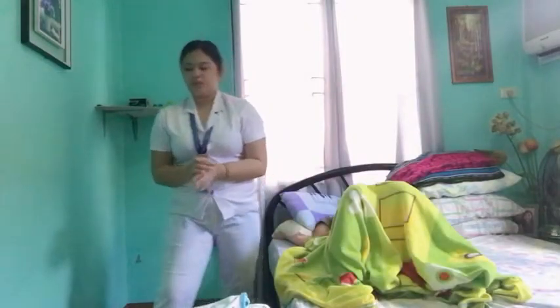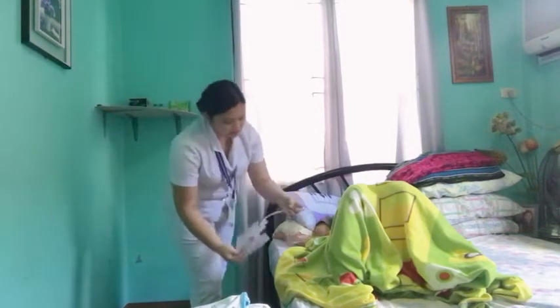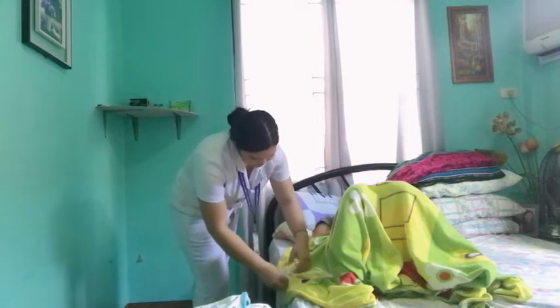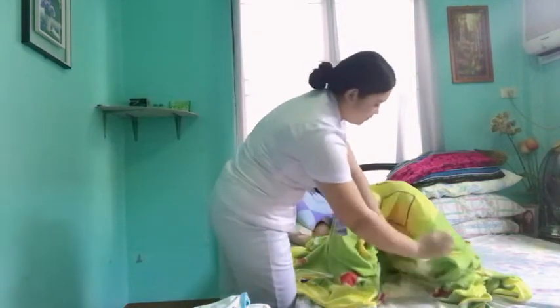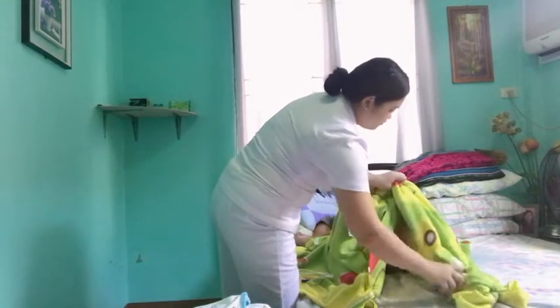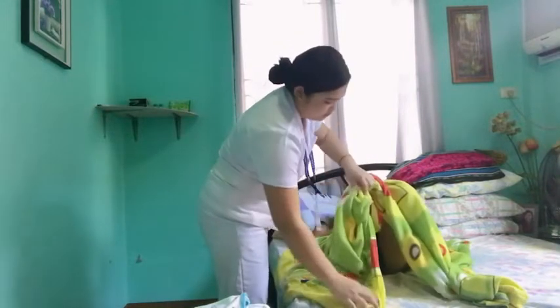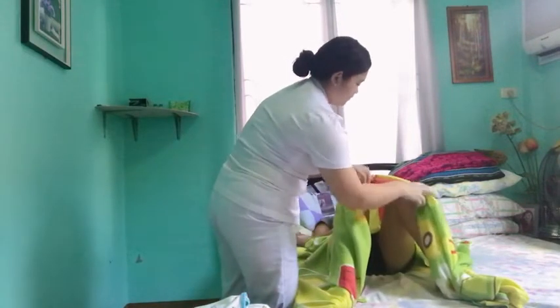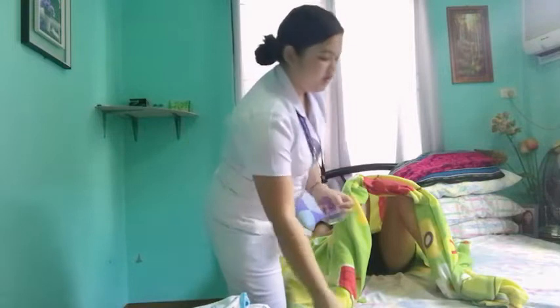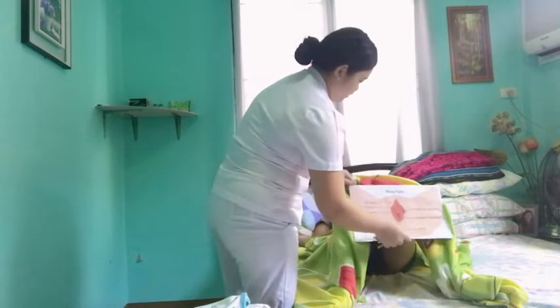So make sure to put the urinary bag on the patient's bed frame. It should be at below waist level. Okay, so now drape the patient, exposing only the genital area. So, since we are not allowed to show a real genitalia, I have here a printed genitalia. I will just put it here.